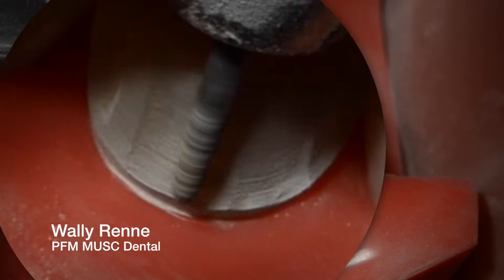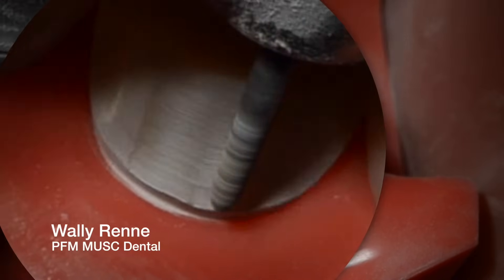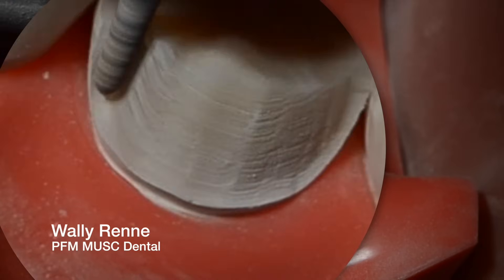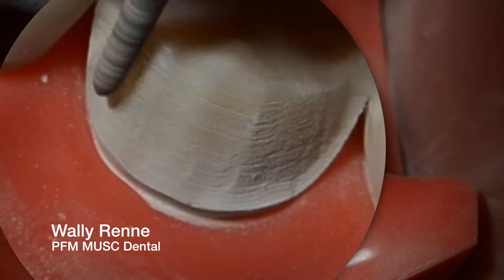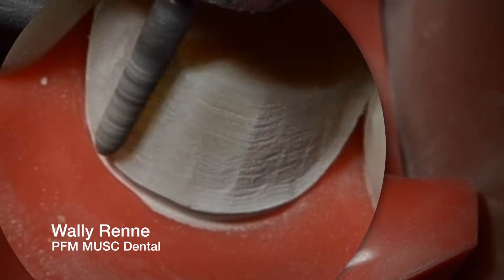I'm just trying to keep it about a half to one millimeter supragingival. Do not hit your tissue — that's just going to be bad. Get it relatively smooth, but don't focus so much on it at this point. You're just trying to do a rough cut gross reduction right here.